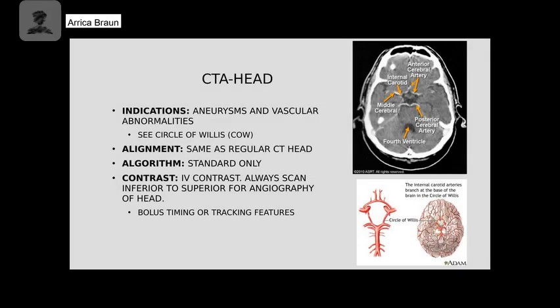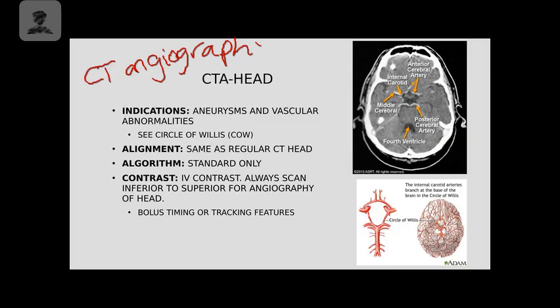The next type of procedure that we're going to talk about is called a CTA of the head. CTA stands for CT angiography, so I'll write that out here for you. CT angiography. You also might hear it called an angiogram.